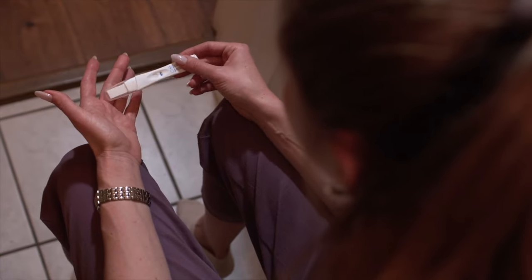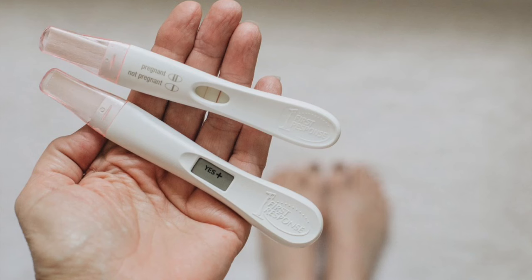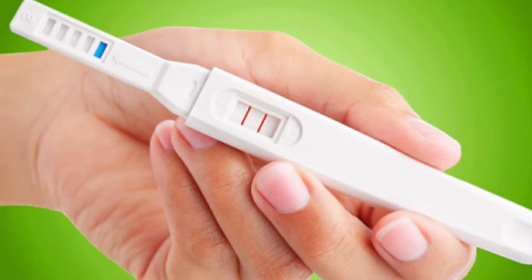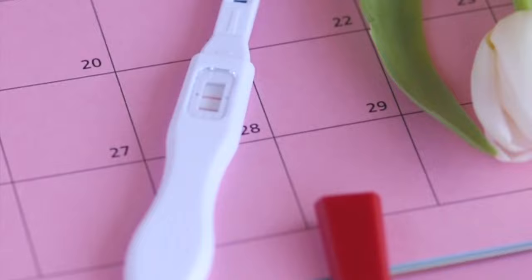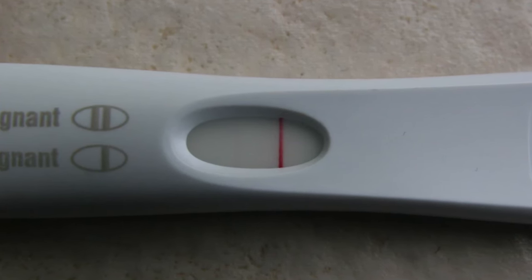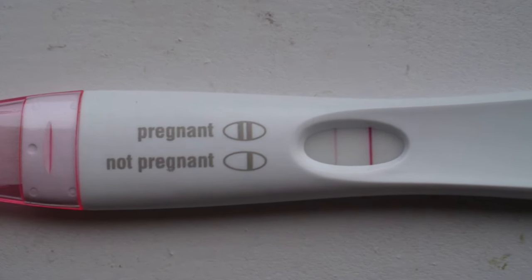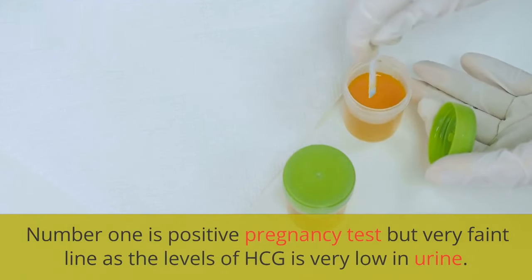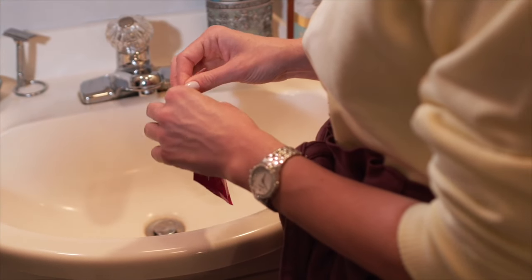So within that time, you have got the result and it has resulted in a faint line. There are 2 lines primarily in the kit. One is the control line that will always come whether you are pregnant or not, and the second line is known as the test line, and we are talking about the test line. It can be faint, with a color that is pink or blue, whatever the brand selects to show the positive result, or sometimes it will not appear and it will clearly show that you are not pregnant. But if this faint line appears within the time frame as instructed in the kit, it means that you are pregnant. The reason behind this faint line is that you have performed this test a bit earlier, when the level of HCG in your urine was not high enough to show you a dark line.